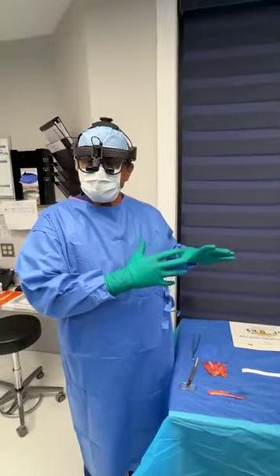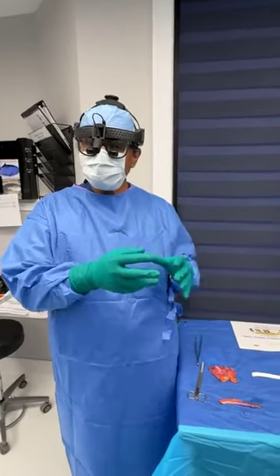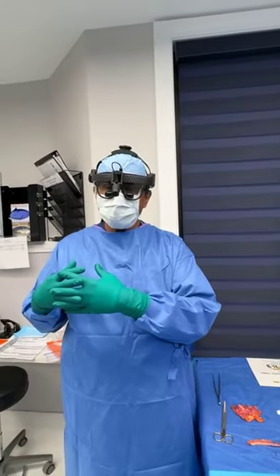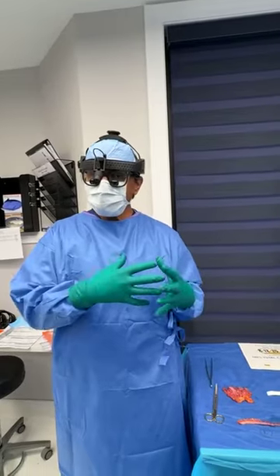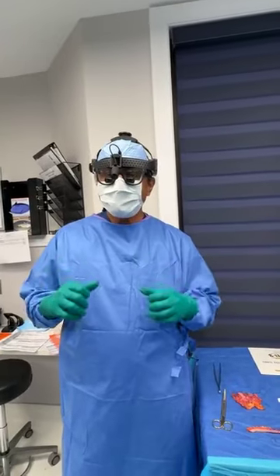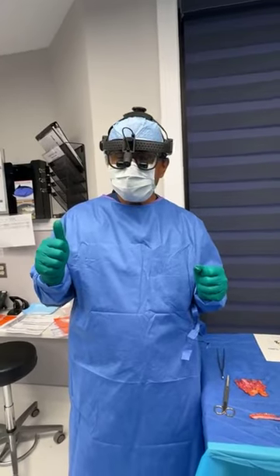So this is one aspect of the video. More importantly, the patient will see the chest wall showing complete removal of the capsule plus the implant plus any of the inflamed tissue below the muscle. And if you put both of these two videos together, the patient will have that convincing evidence that the entirety of the capsule was indeed very much removed in the manner as described.